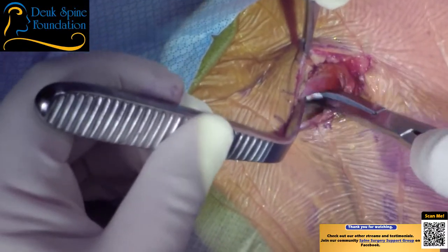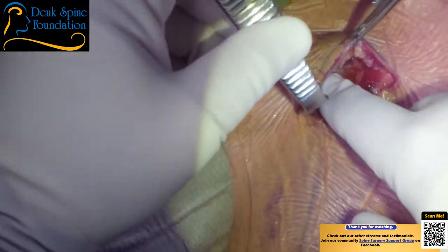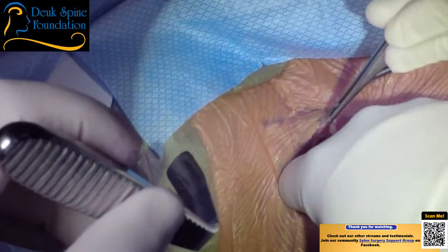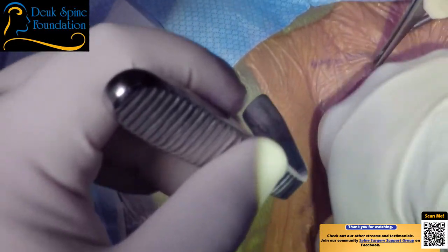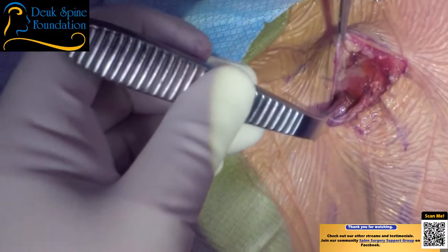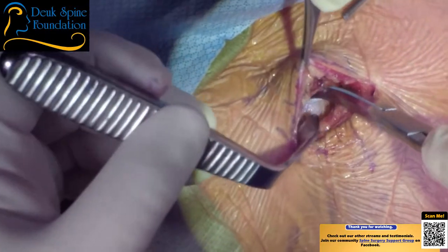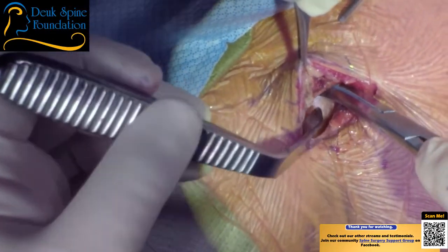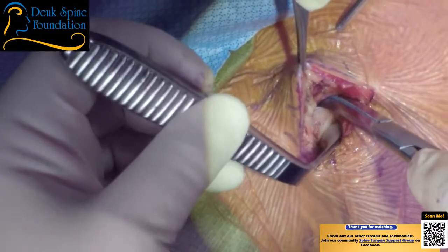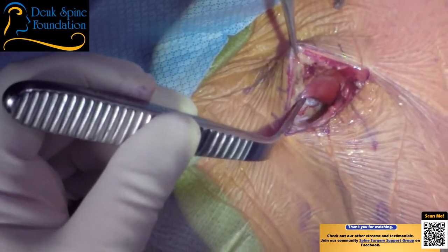And he has a very deep neck. Okay. Let me just feel. I feel the spine. I'm right on top of the discs. I can feel it. I just don't know which disc because we haven't checked yet. Kitty. But yeah, definitely making some progress here. Once again, the surgery is very difficult to do on a patient who has a very thick neck.